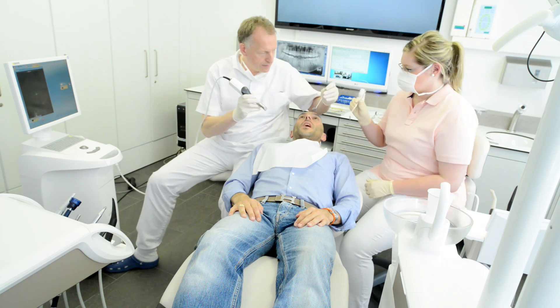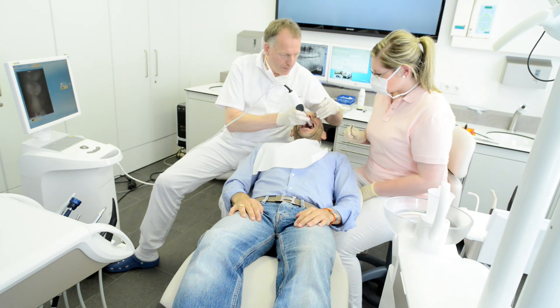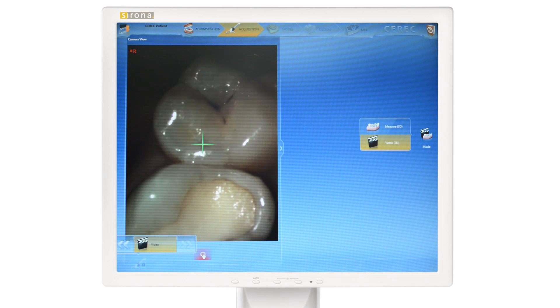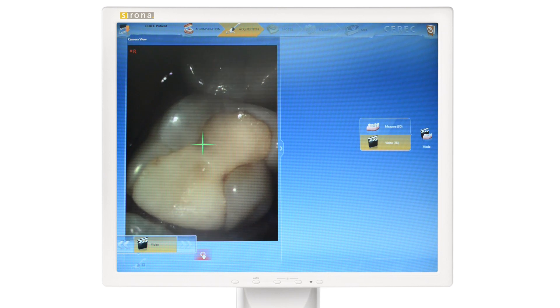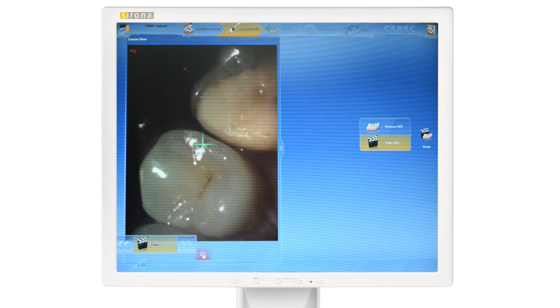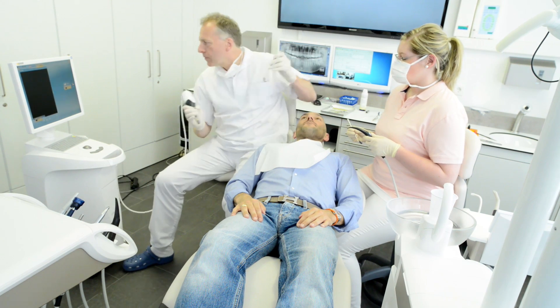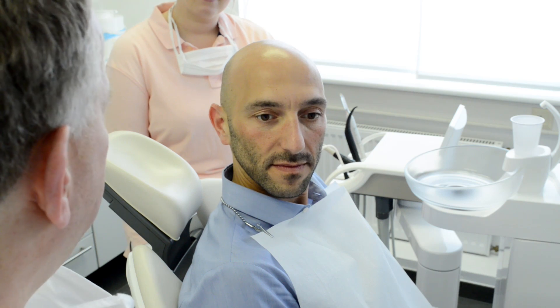We'll start with the patient counseling mode, available only with OmniCam. Using the full color camera, a video of the situation can be made and used for patient education and clinical security. Once the patient accepts the case plan, treatment can begin.